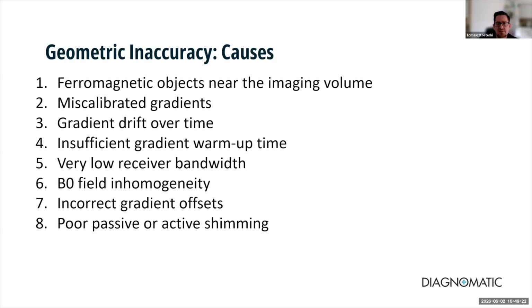If the problem remains after repeating the measurement, then the likely causes are more technical, such as gradient miscalibration, magnetic field inhomogeneity, incorrect gradient offsets, or poor shimming. This usually requires a service engineer.